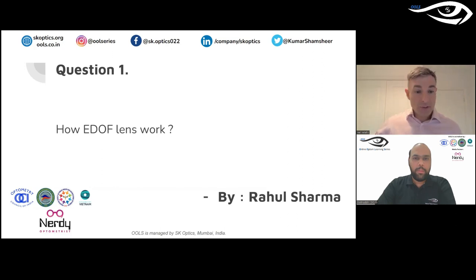Yeah. So, I mean, with those, and of course, there's been talk about how useful they may be in myopia management as well. What they're really trying to do is, you know, have the distance in the center. And, you know, they're working on the principle of stretching that focal point across the retina. And what they're trying to do is create an area which the image is good enough so that you're getting a bit more of a balance. So whereas with other designs, you've got a set power here and a set power somewhere else on the lens, so that if you look in that position, you're getting maximal vision. What this is trying to do is almost give a bit more of a balance as a blend across, which the brain again interprets. But the whole hope here is that you've got more depth as well.